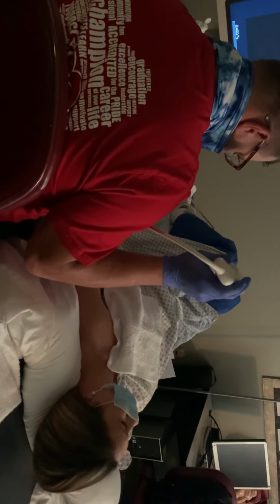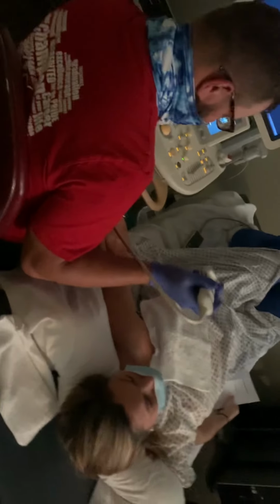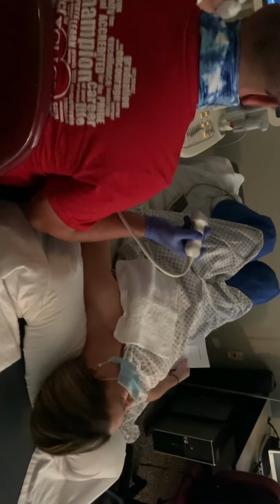Now, axillary. And this is where this exam gets a little bit tricky. Here's what I like to do. I'm going to take your arm and lay it right across my lap. And this is where you can really adjust the bed to help you. Good. Because I don't want any strain on the arm. I want the muscles as relaxed as possible, because if they are strained, it's going to collapse the veins.